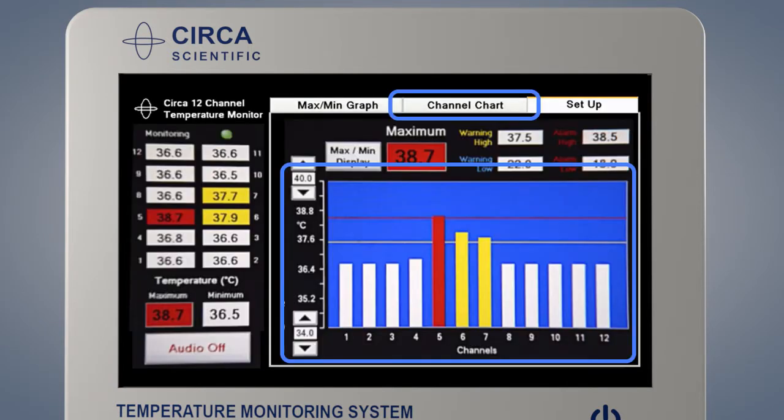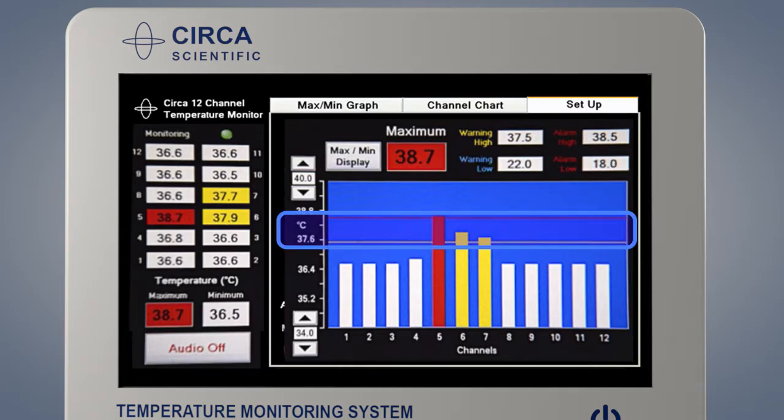Press the channel chart tab to display the channel chart screen. The channel chart screen displays the temperature of all 12 temperature sensors in an easy-to-understand bar graph. The temperatures are displayed from 1 to 12. Sensor 1 is the most distal sensor, which is closest to the stomach. Sensor 12 is the most proximal sensor, which is closest to the mouth. The channel chart graph also displays the current warning and alarm settings by yellow, blue, or red lines on the graph. The sensor temperature display and the corresponding bars change colors as temperatures reach warning and alarm limits.